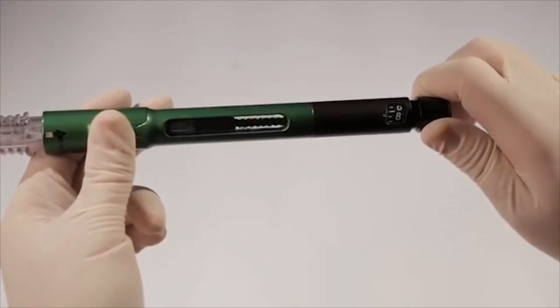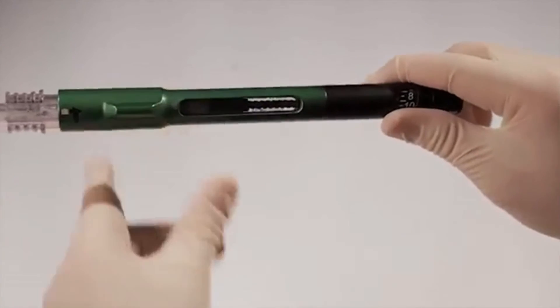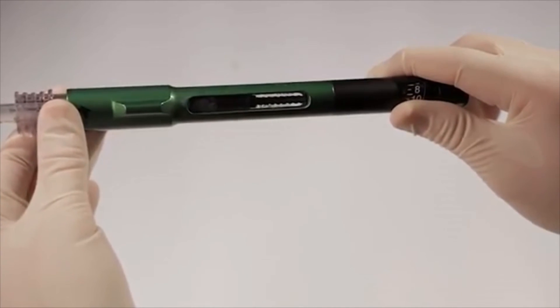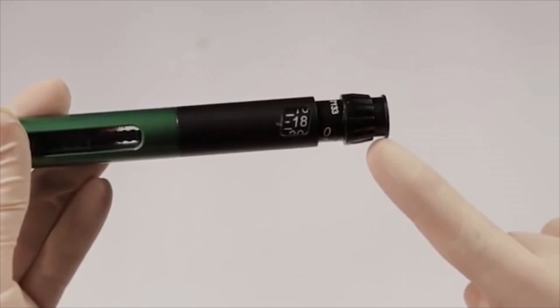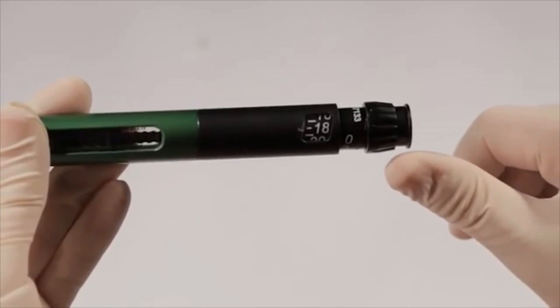If the pen will not dial all the way to the number you desire, this is an indication that the 3-milliliter cartridge does not have enough solution to mix the full amount you wish. You will need to replace the 3-milliliter cartridge. It is important to push the dispensing button straight in without pressing against the rotating dial or pressing at an angle.